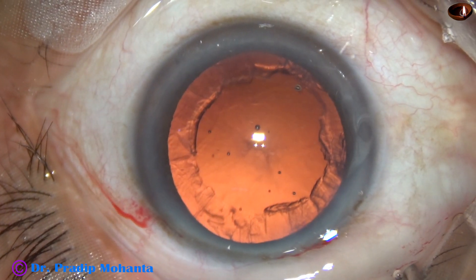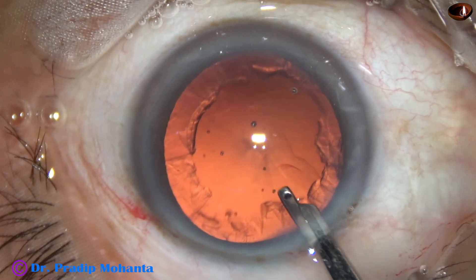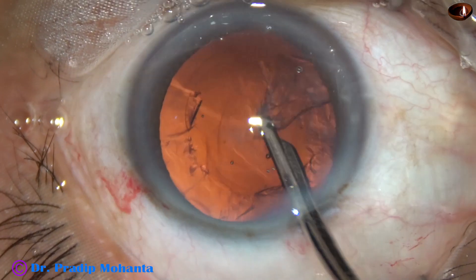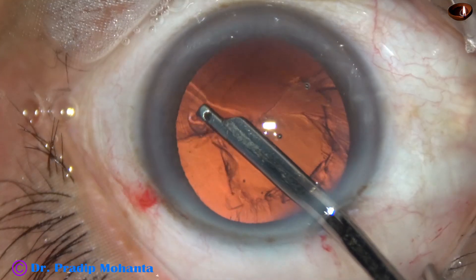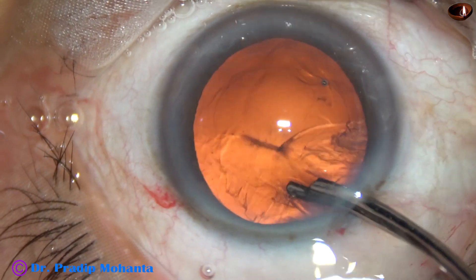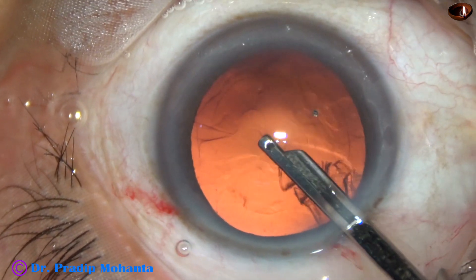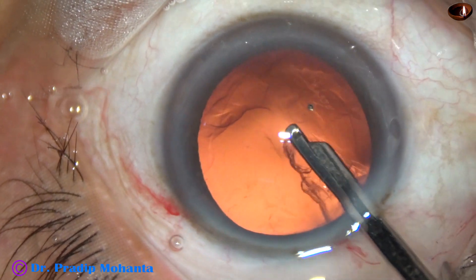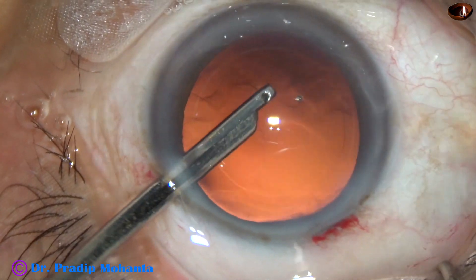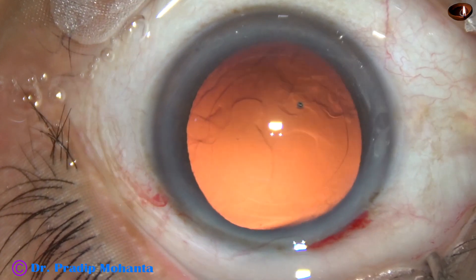Some more 2% HPMC. And now I use a 23G Simco to remove the cortex. Cortex from the inferior aspect has been removed. Now the cortex from the superior aspect is being removed. A little cortex is there in the sub-incisional area and it has been removed.